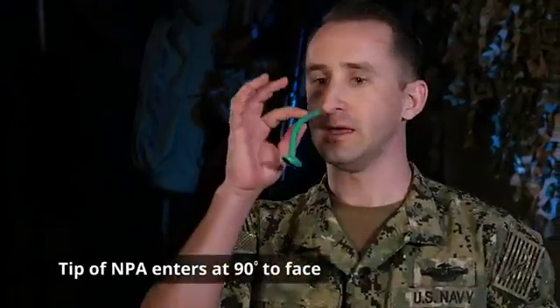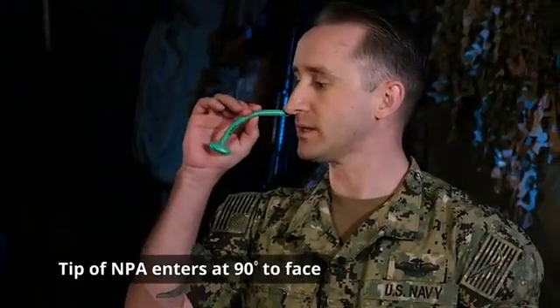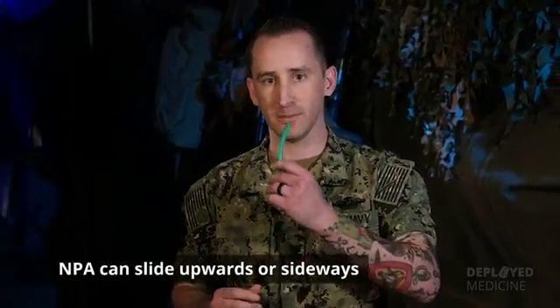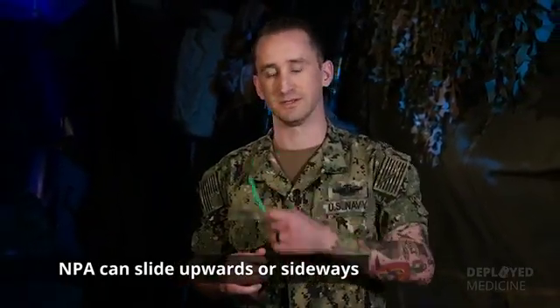When I say 90-degree angle, I mean the tip of the NPA needs to go in directly 90 degrees relative to the patient's face. The reason for this is that if you don't, the NPA can slide upwards or to the side.